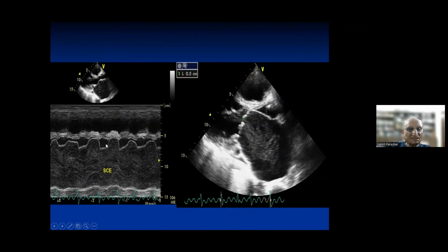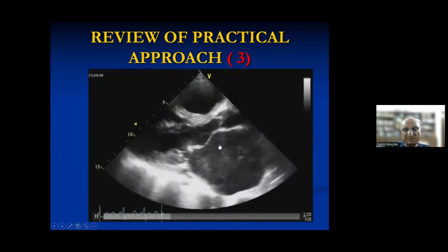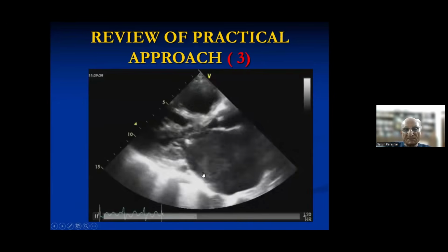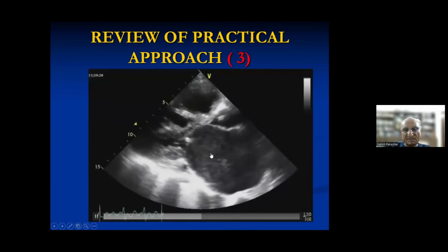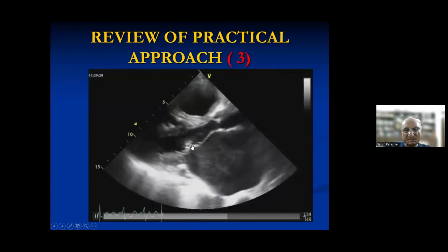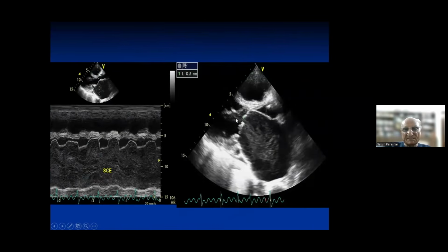Now here you see there was a spontaneous contrast echo. So we got it just out of clinical interest. Here you see the opening of the mitral valve, separation index only 5. So what you see in a parasternal long axis view is for any LV. So what you see here is any clot in the LA, what is the type of the mitral leaflet, and what is the separation index. So three things you see in this view.